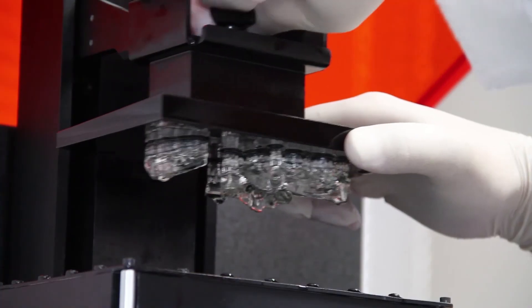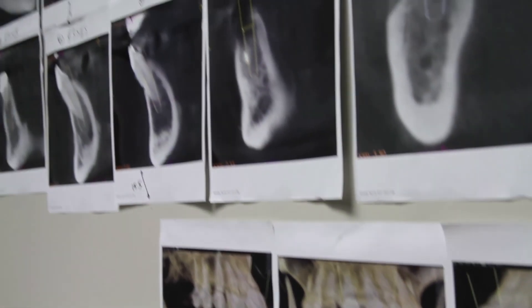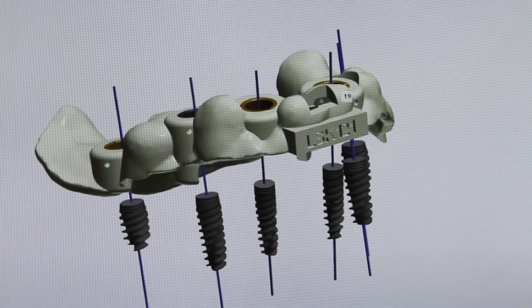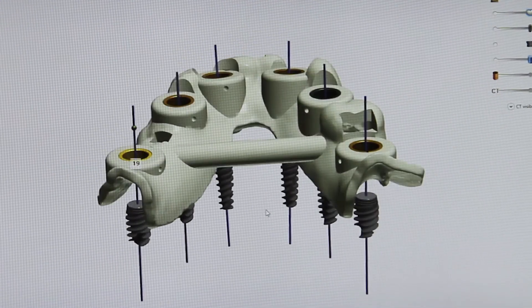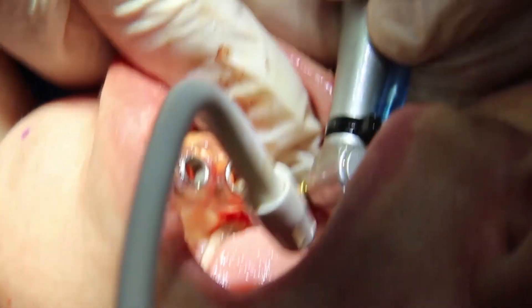Envision Tech Vida is not only fast, but also really accurate. That's why we are using this 3D printer for printing our surgical guides. Our dentists on staff designed a new type of surgical guide that is tooth-borne for stability, and the doctor performs the surgery minimally invasive. We know which area we have to put the implant. So it's going to be more comfortable for the patient, reduce healing time, and reduce chair time for the doctors with the use of digital printing of this surgical guide.